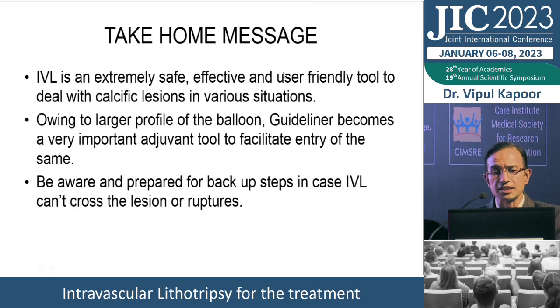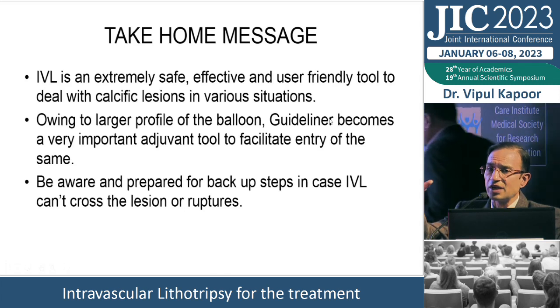So the take-home message is pretty simple: IVL is an extremely safe, effective, user-friendly tool to deal with calcific lesions in various situations. Owing to the larger profile of the balloon, like in this case, the guide liner becomes a very important adjuvant tool to facilitate its entry. Be aware and prepared for backup steps in case the IVL can't cross the lesion or it ruptures. Very unlikely that it ruptures, but in case it does, most of the time it does not create a problem because it is at a very low pressure.